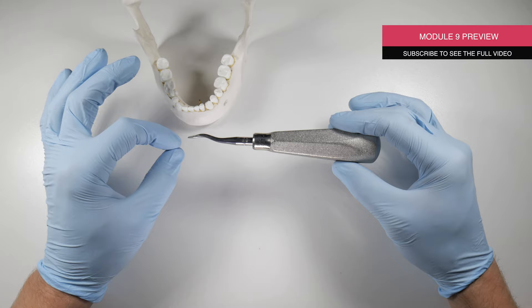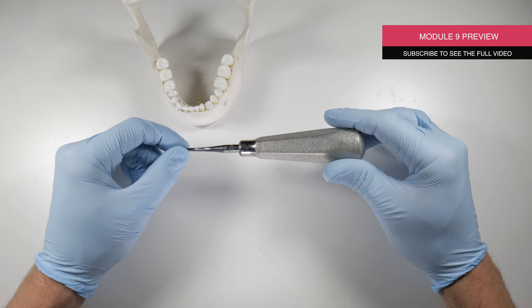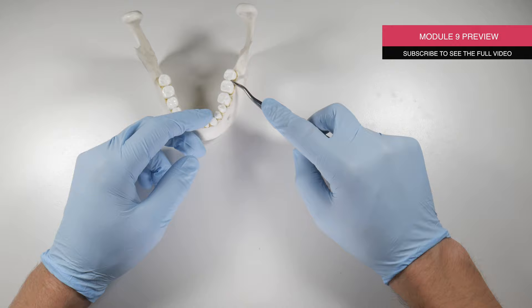help you understand why we use the elevator the way that we do to make it as optimal as possible when we're using it in the mouth. The performance of this should allow you, if you're using it appropriately, to sometimes even take teeth out without the use of a forcep.